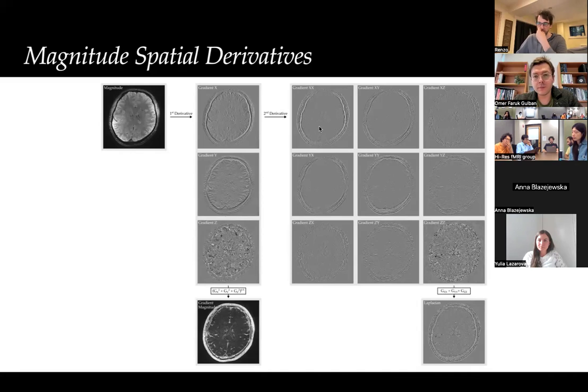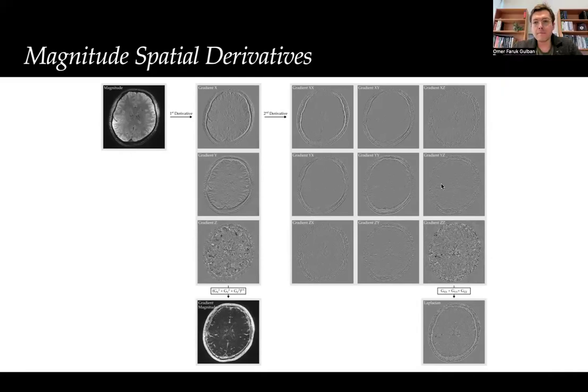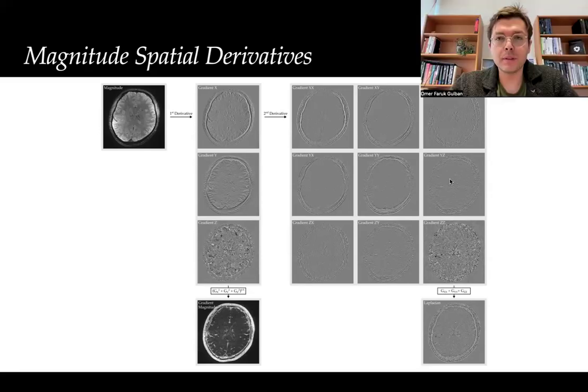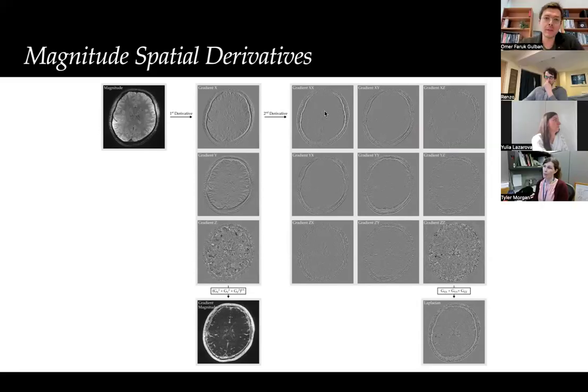Some people call it a structure tensor. In other contexts, this is called the second moment matrix. In other contexts, this is called the Hessian of the image or Hessian of whatever. There are many names for it, and this 3x3 structure is a very useful structure. If any of you used, for instance, Frangi filters in the past, or diffusion filters, structure tensor filters, they all leverage this structure. So 9 values per voxel derived from a singular scalar valued image.